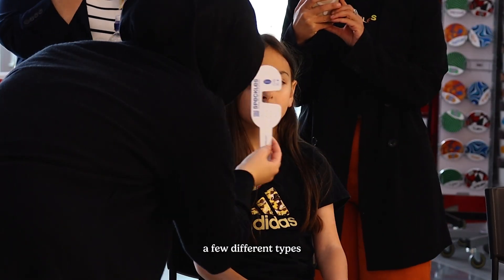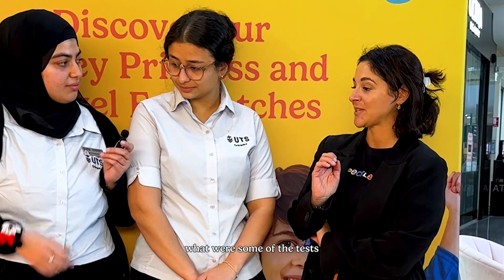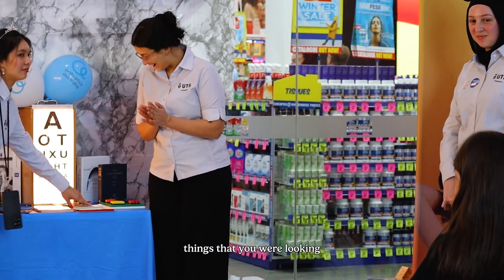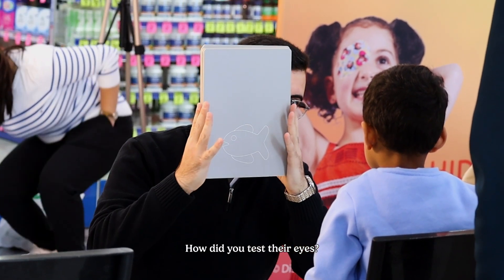You guys did a few different types of tests with vision on the children. Can you explain what were some of the tests you used today? For example, you've got the vision charts here. What were some of the other things you were looking at for children that were maybe a bit younger? How did you test their eyes?